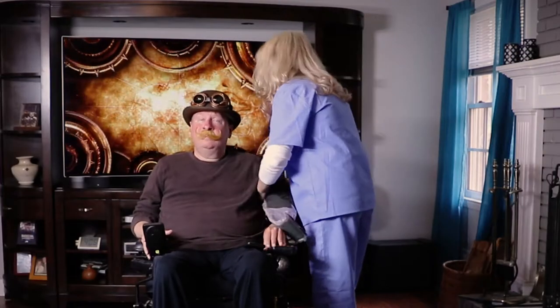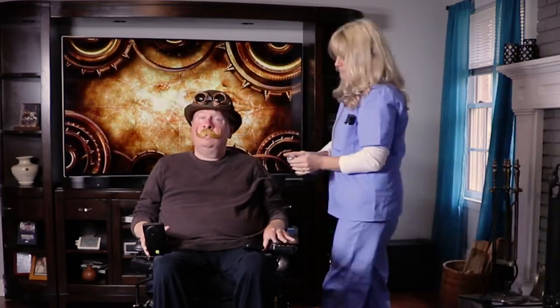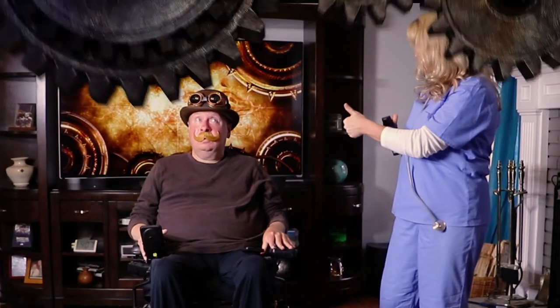First, I need to make sure I'm up for the physical task. Now that I've been cleared, let's do this.